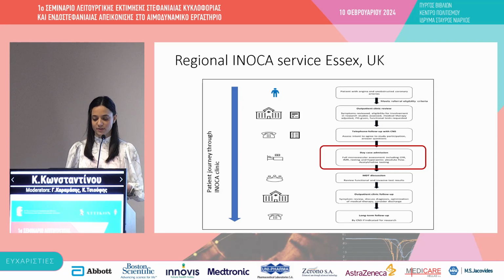But what we do is we receive referrals of patients who've already had an invasive coronary angiogram or CT coronary angiogram and have unobstructed coronaries, but persisting chest pain. We review them in a clinic, and then we list them for an invasive microvascular function assessment.